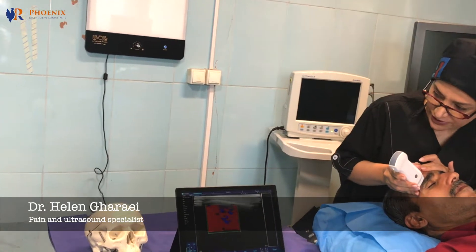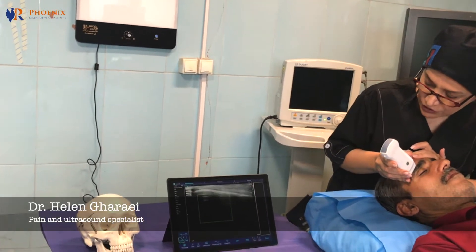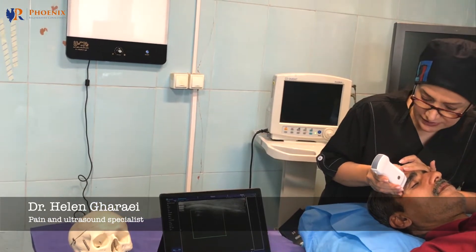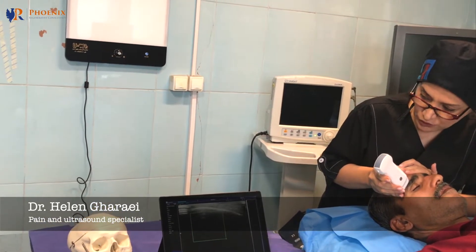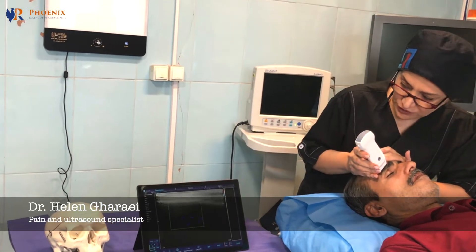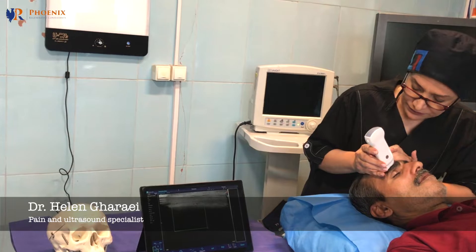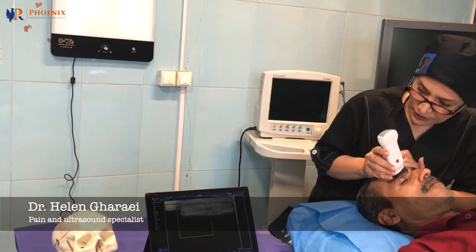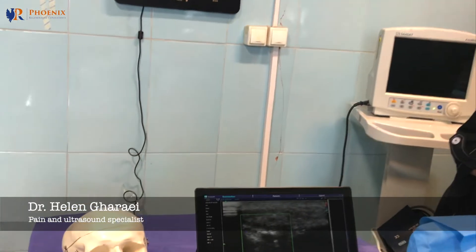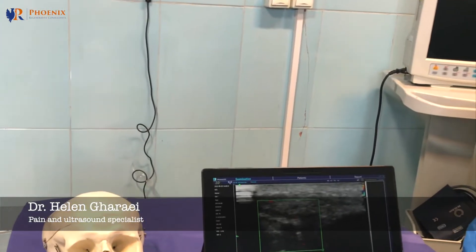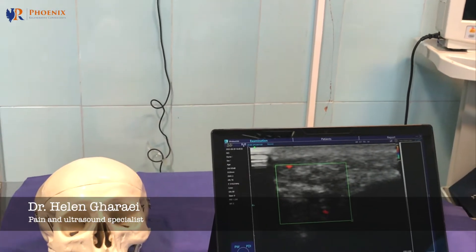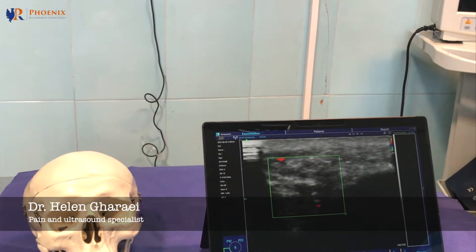Starting from here, you can see the hyperechoic shadow of the supraorbital rim. Move inward, and then you can see the wedge shape and the pulse of the supraorbital artery.